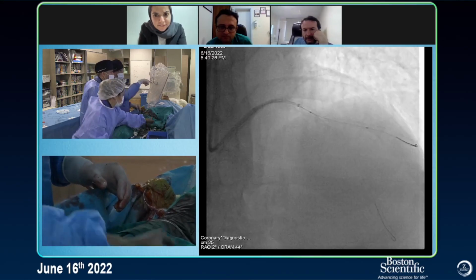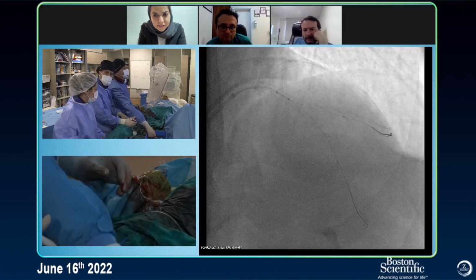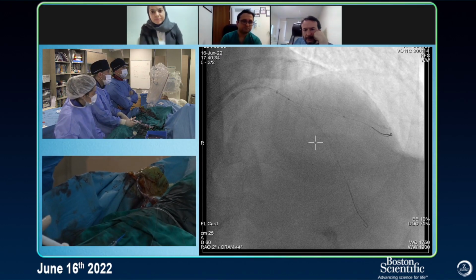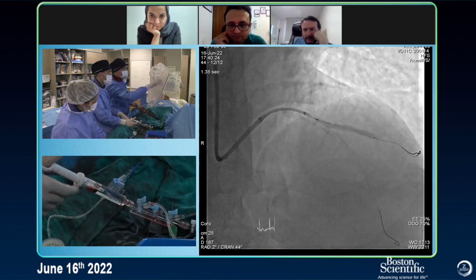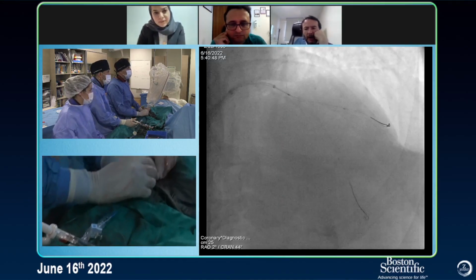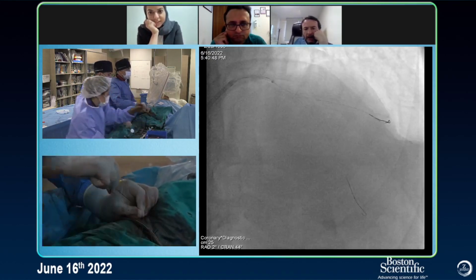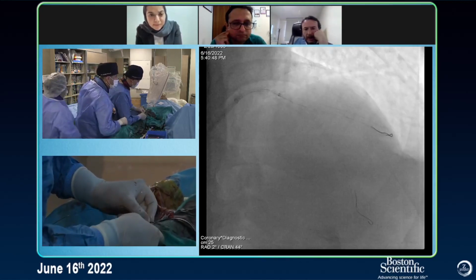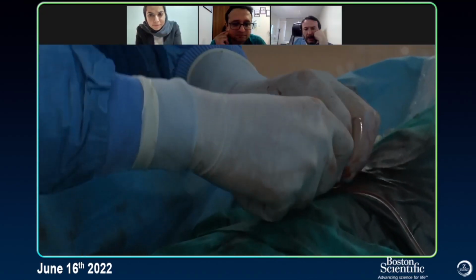I don't like the proximal part. The proximal, what do you think? It's not opening. Okay. Go up. Do you want to take an NC first? 3.5 for POT, yeah? No, 3.75. NC. Okay.